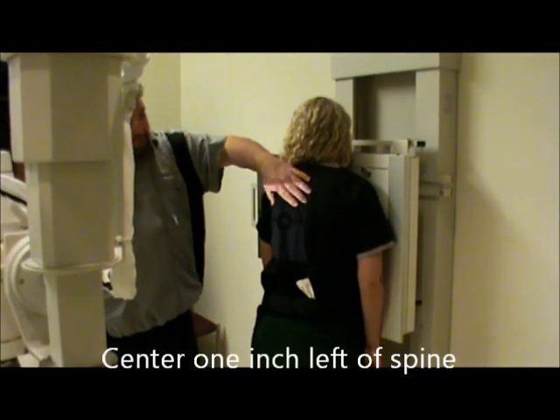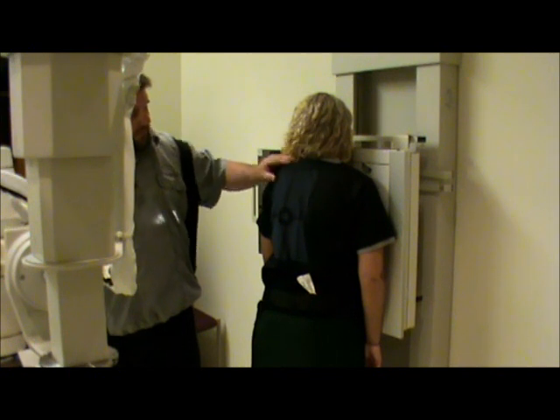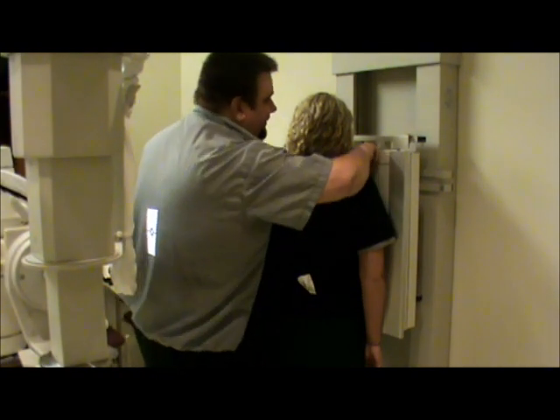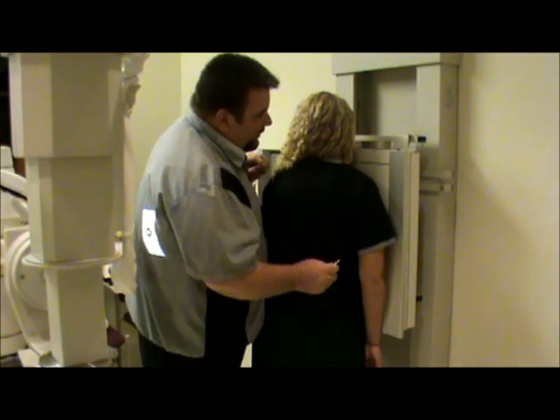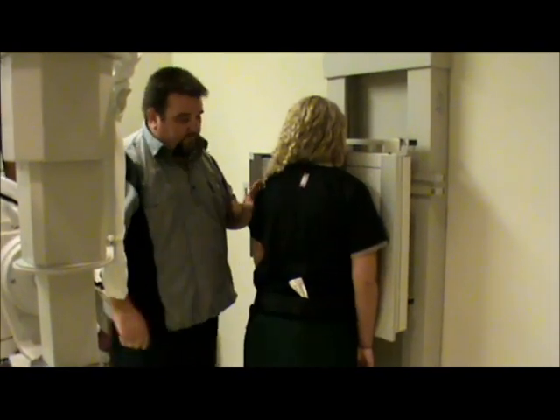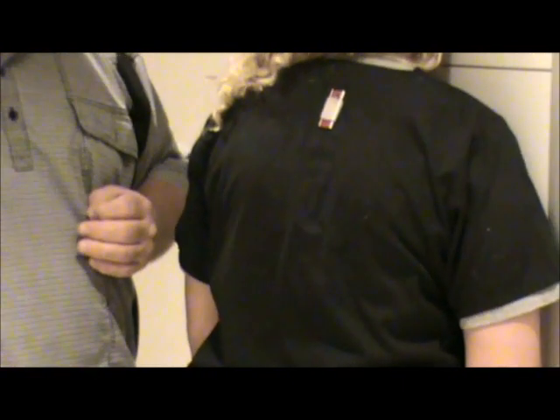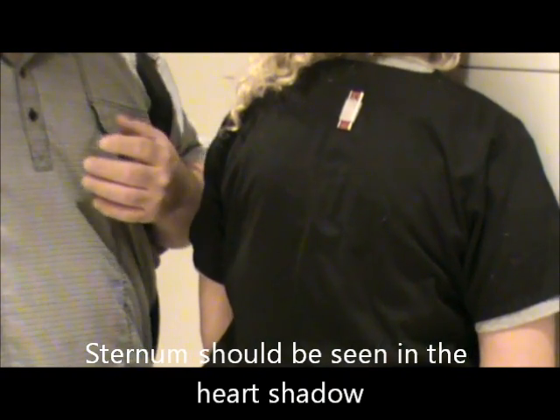Our collimation is going to be to the sternum itself lengthwise and then about four inches wide. For marker placement, the patient is in an RAO position so we are going to use the right marker. We can either put it on the patient on the back of their shirt, which is probably the easiest way, or you can put it on the board. What we're trying to do with the oblique is visualize the sternum in the heart shadow.